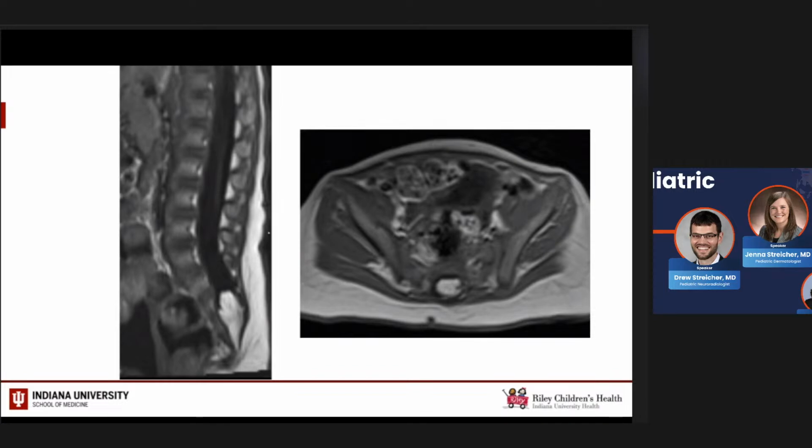So this was an example, a patient that had one of those lumbosacral segmental hemangiomas, which I will say a lot of times, if these are more flat or plaque-like, you don't really appreciate them that well on imaging, and that's not the purpose of doing the exam. So it's not something you need to fret about. We're looking for the associated anomalies, particularly dysraphism. I just want to point that out.